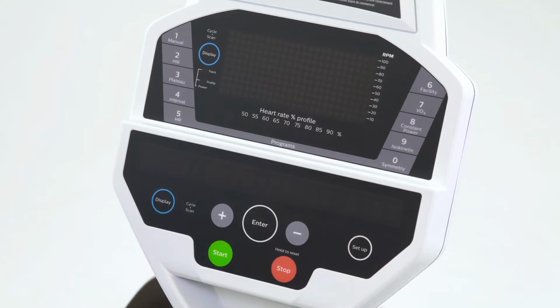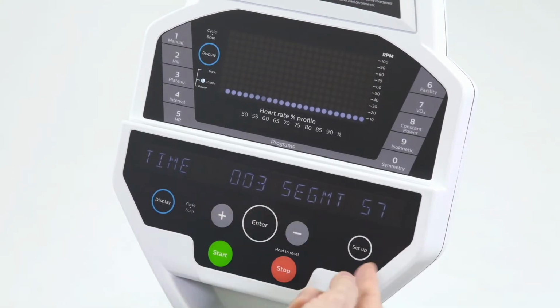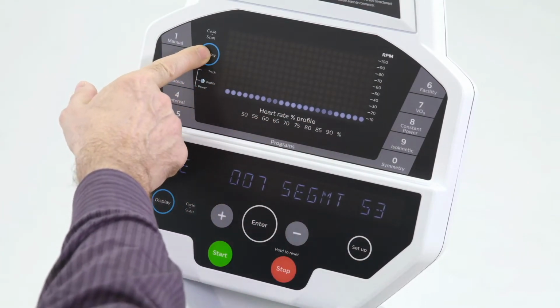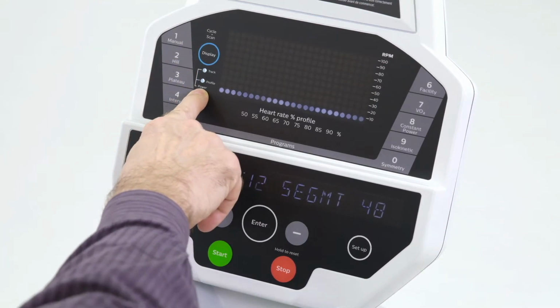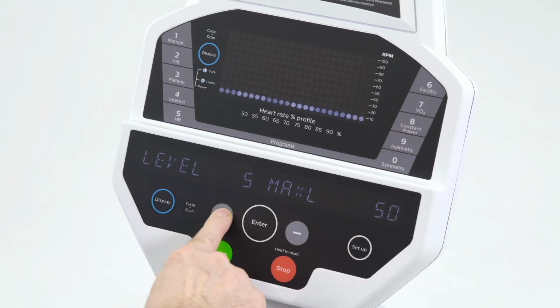In the setup, we were able to set up how many watts per row on our display, so I'm going to show how that works. So right now, the default was 10 watts per row. So right now I have 1 row of lights. If I come here and I press the display button, both of these light up, which indicates I am now on the power display. So this now indicates power.